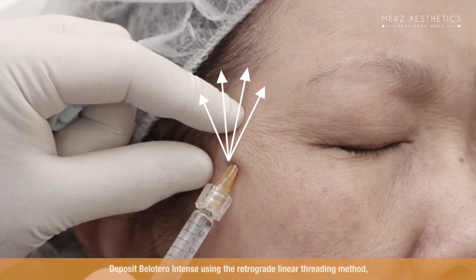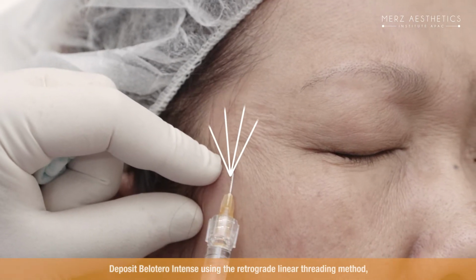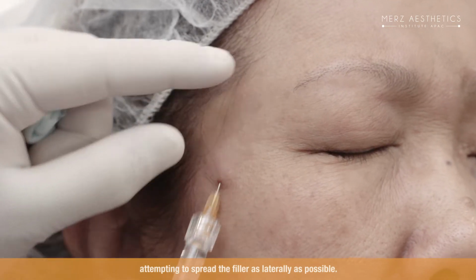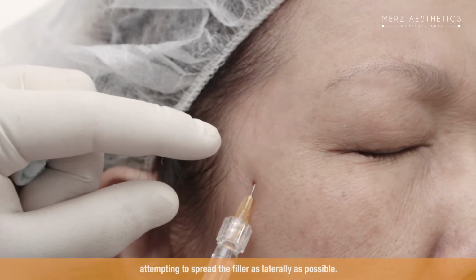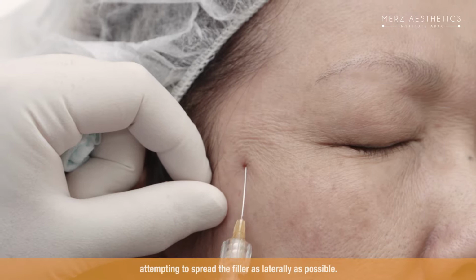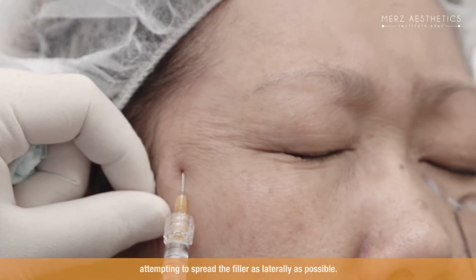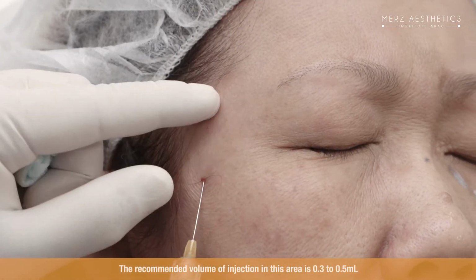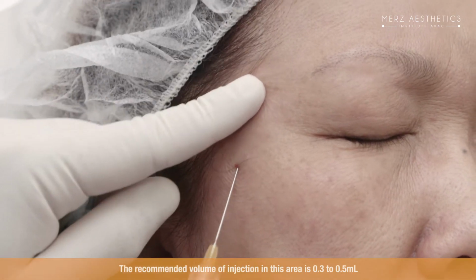Slowly deposit Belotero Intense using the retrograde linear threading method. Attempt to spread the filler as laterally as possible. Remember, the intention here is not to fill the temporal hollow, but to tense up the superficial temporal fat pad. The recommended volume of injection in this area is 0.3 to 0.5 milliliter.